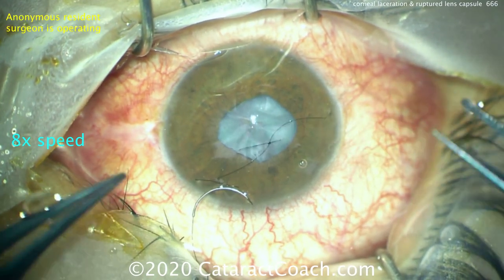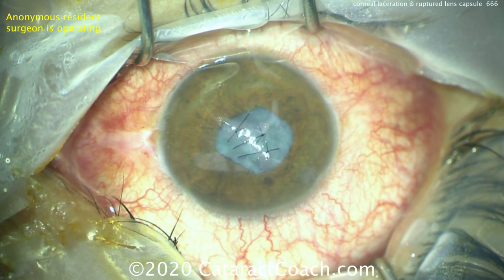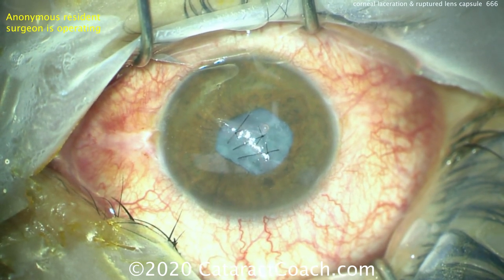Here's the suturing. There's the first suture going in. Now we've got three or four sutures coming, and the eye is starting to look a lot better.